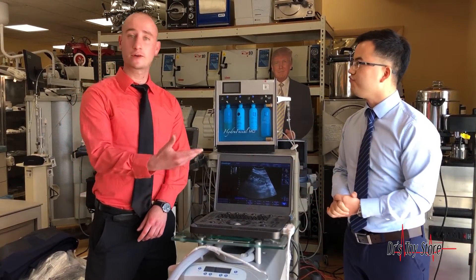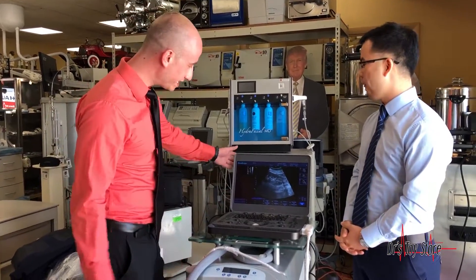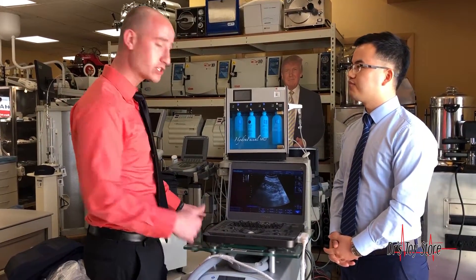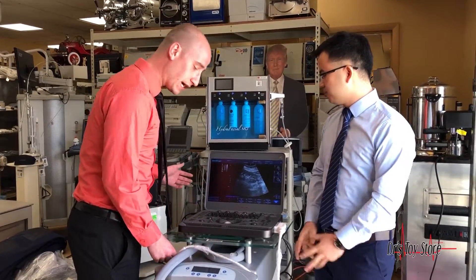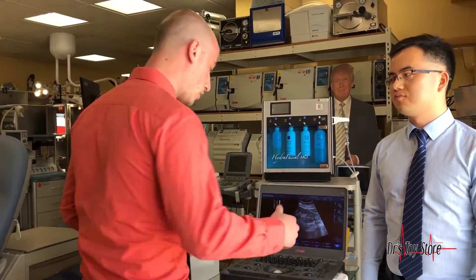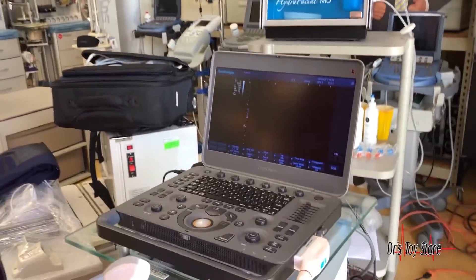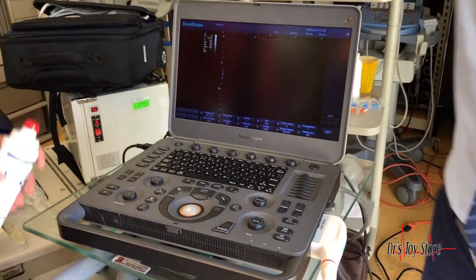Thank you very much. Thank you for coming over here from China — flew in from China just to come to the Doctor's Toy store to show us the X5 from Sonoscape. Sonoscape just launched this beautiful product. It's an ultrasound that has color Doppler and the works, and here we have an abdominal probe. Let me grab some ultrasound gel. What this ultrasound is really primarily used for is its portability.